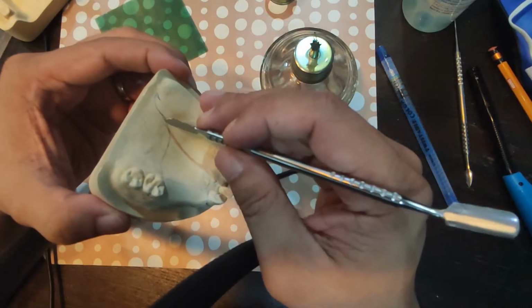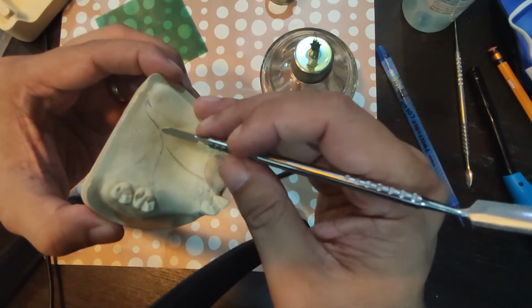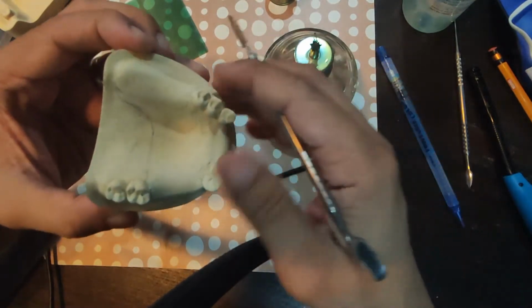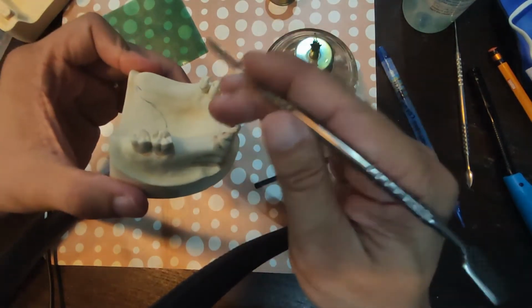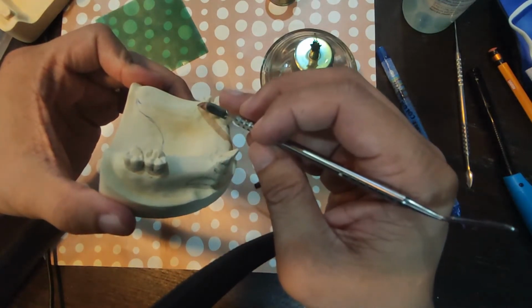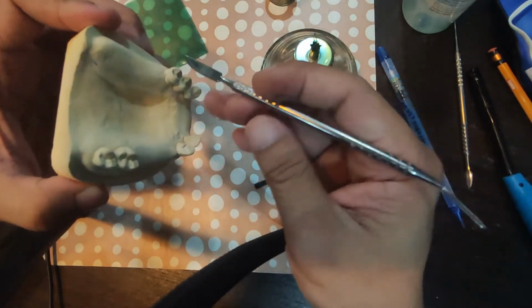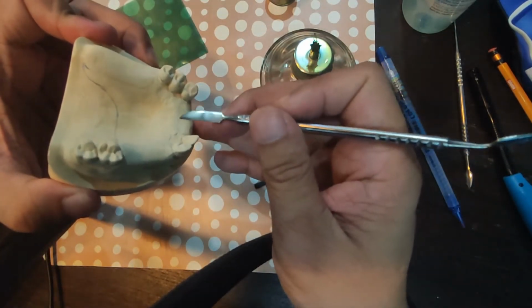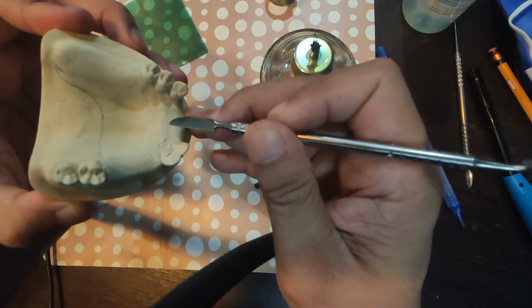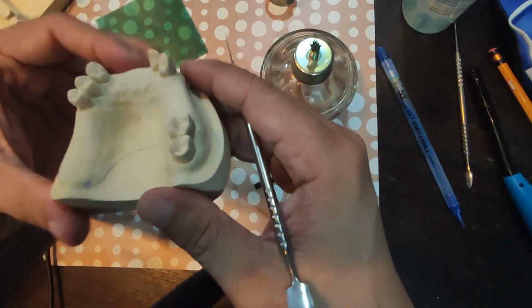The border of my major connector is right here, so I know that this part would need to be scored or beaded. And I know where my resin base is going to start from. So I know kung saan siya kailangan maglagay ng relief. And here I know where it's marked, slightly lang, no, in blue. So I know where to put my wax reliefs.